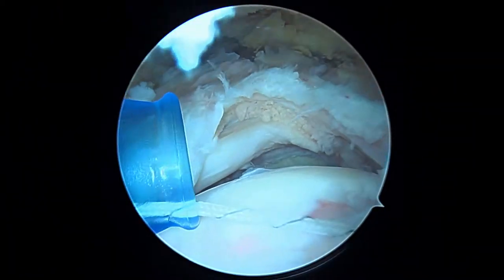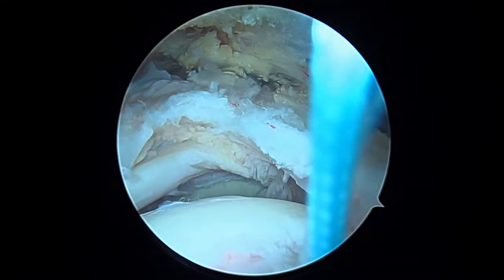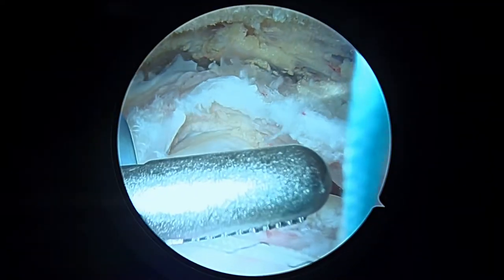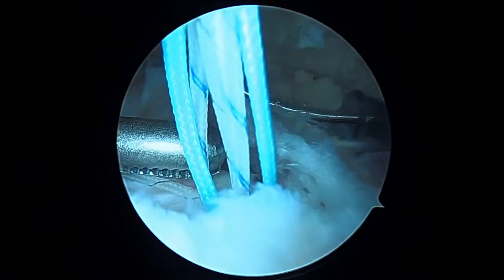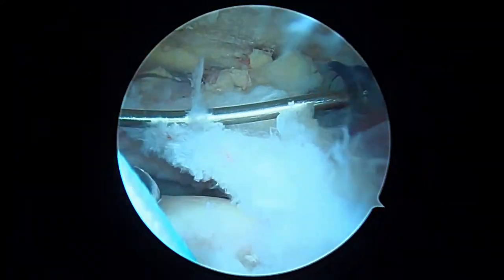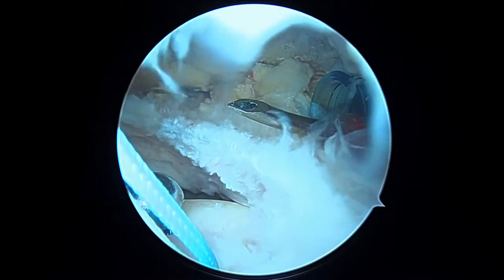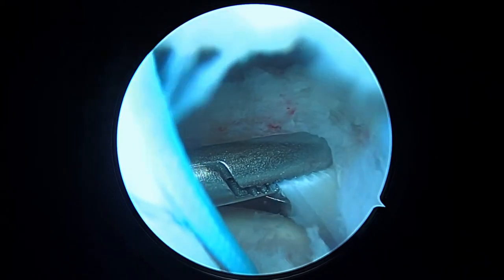Now we're going to take an instrument called the suture hook — a grasper in the front and a suture hook in the back. Here's the grasper coming in the front; the suture hook is coming in on the right side of the screen. This hook is loaded with the black wire called the super shuttle — that's how we move these sutures around. With this instrument I want to make sure I get this deep layer, so I'm going to reach in underneath and lift that up. That's where we're going to come out — and that's our first bite.